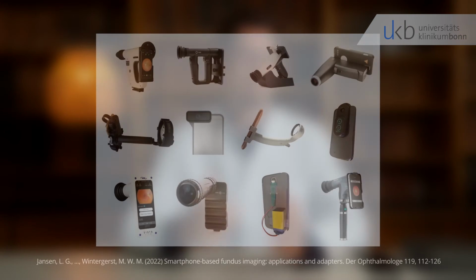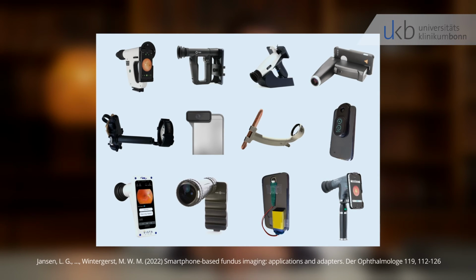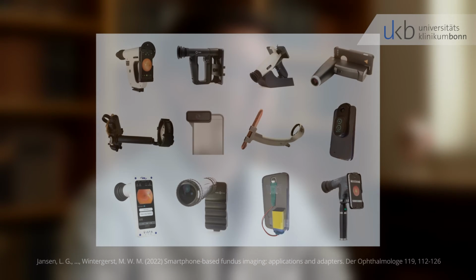In many world regions, costs remain a challenging barrier for implementation of diabetic retinopathy screenings. However, most adapters for smartphone-based fundus imaging are less cost-intensive as compared to conventional devices. Therefore, this approach can allow screening where it might otherwise not be available.